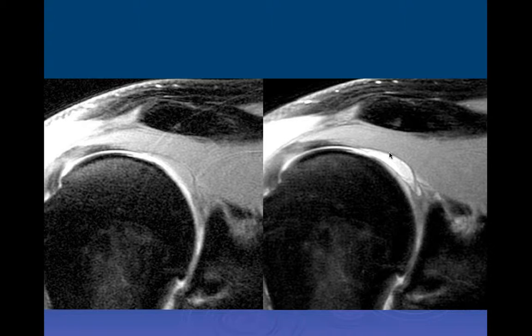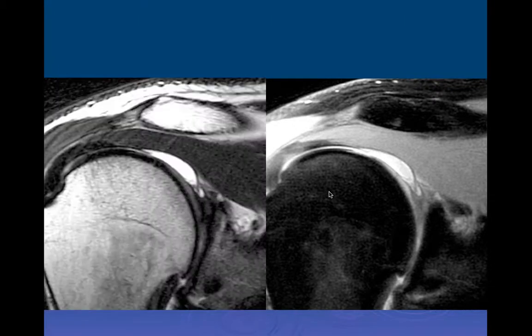It looks like on the left image is a rotator cuff with just a little bit of tendinosis in it, and then you move on to the next image, and it looks like there is kind of an elongated fluid collection extending probably from the biceps anchor. So you wonder if there's a cyst or a partial tear of the proximal biceps tendon extending into the biceps anchor.